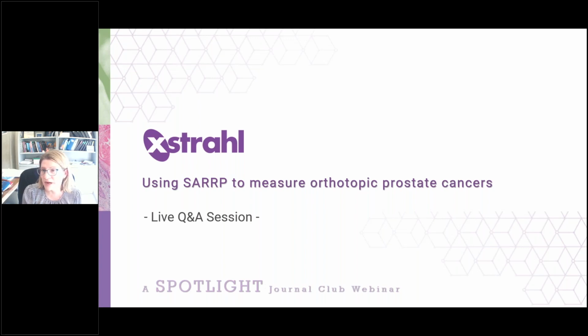Like pancreatic cancer, the pancreas is really difficult to see on CT. So if you have a tissue that really does not show up very well on the CT, you could put that on there, and that would also help. We have done pancreatic tumors.